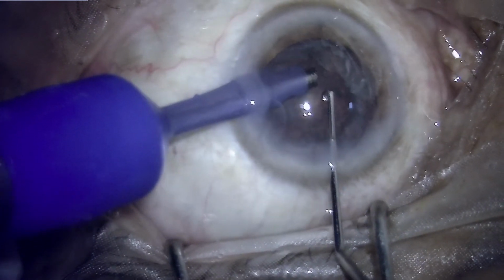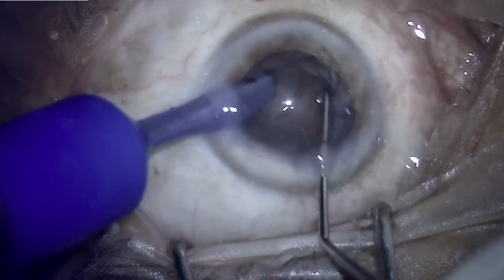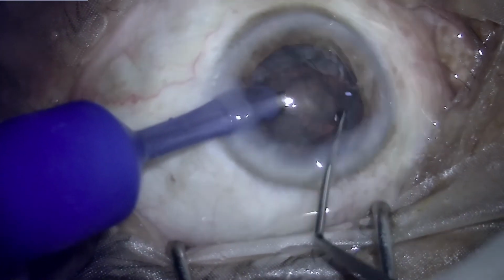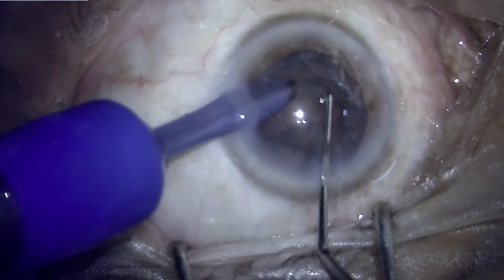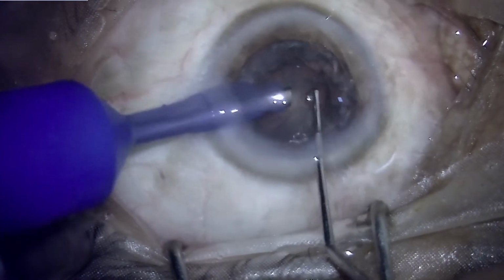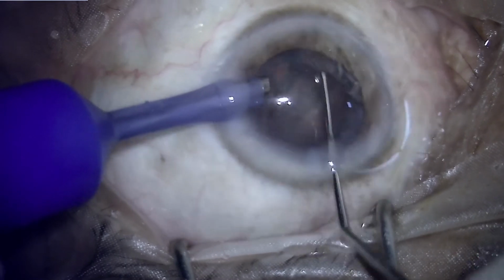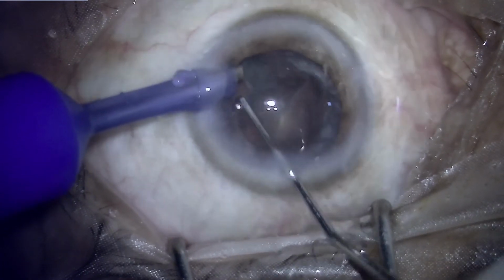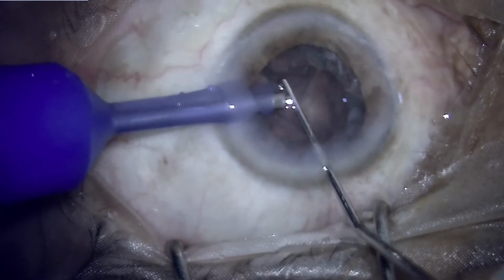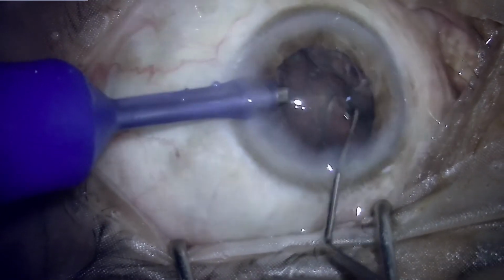So here the surgeon is trying to rotate the nucleus and sees an opportunity where the nuclear plate can be flipped up by catching hold at a particular point. But because the nucleus is so soft, there is hardly any capability of the nucleus to be held by the phaco tip, because as soon as the vacuum is created, that portion of the nucleus simply bites off. So it was taking a long time to get this out.